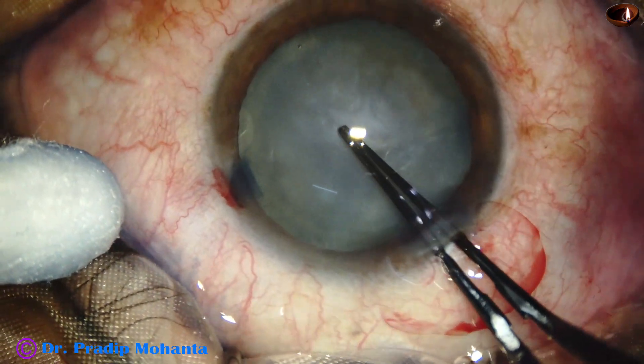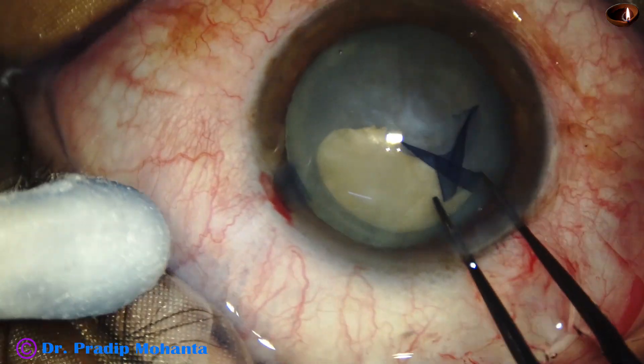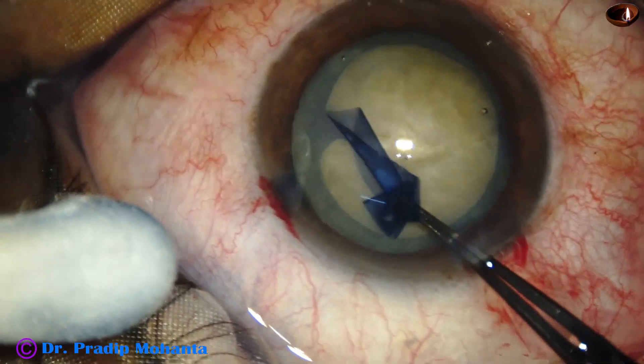The center of the anterior capsule is punctured with the tip of the utrata. We get a capsular tag. This capsular tag is guided anticlockwise all around, and we get a round rhexis.